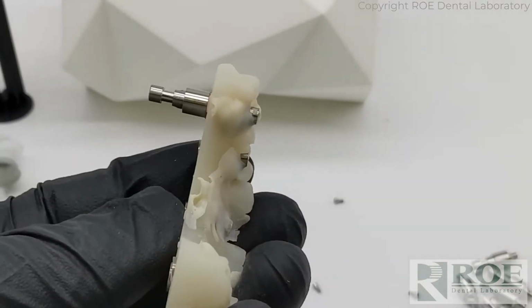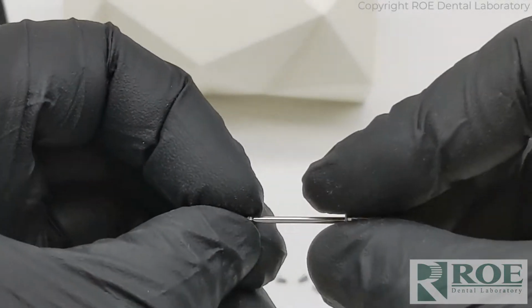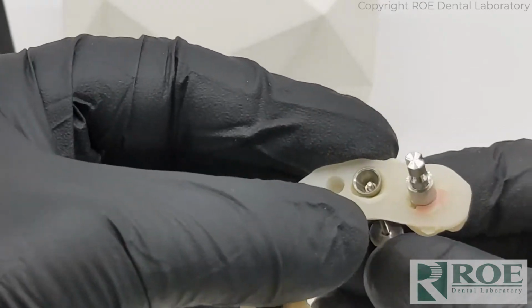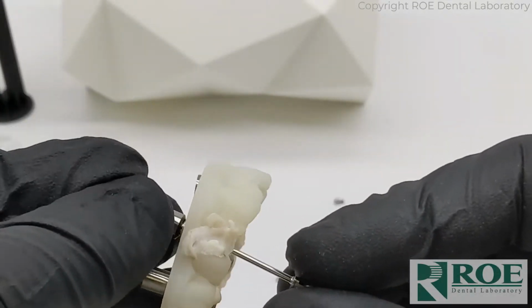Okay, so I've already added the first one. All right, add the analog. So add another one here just for demonstration purposes. Right, so prosthetic screw, drop it in from the occlusal, and then just simply add an analog to that site.